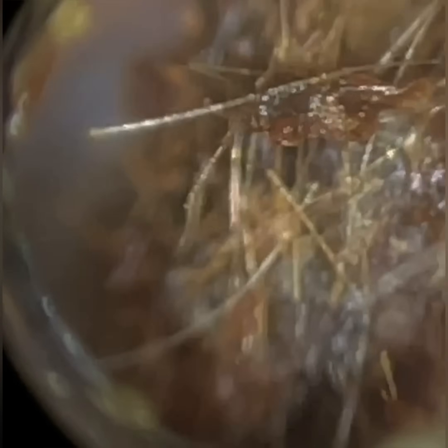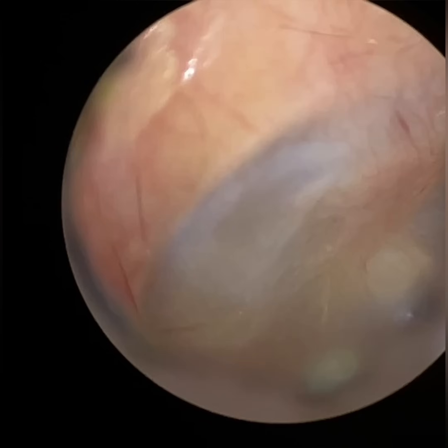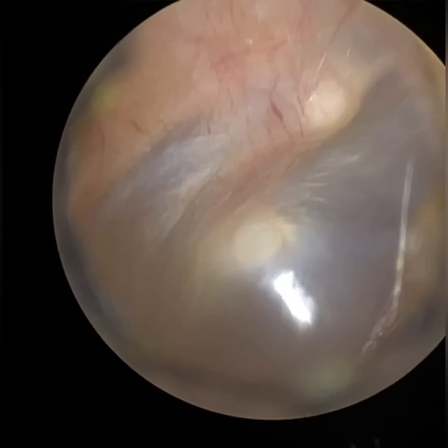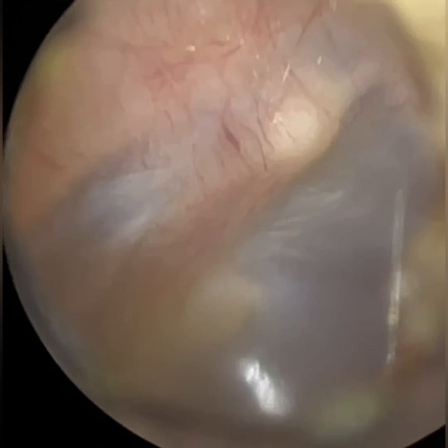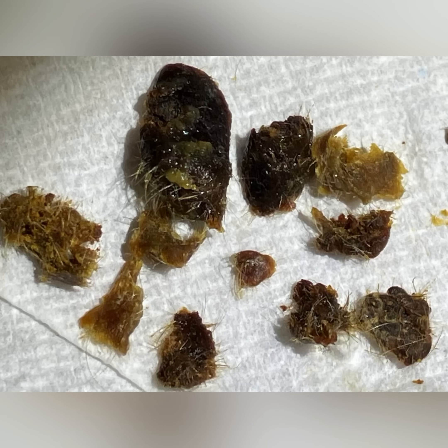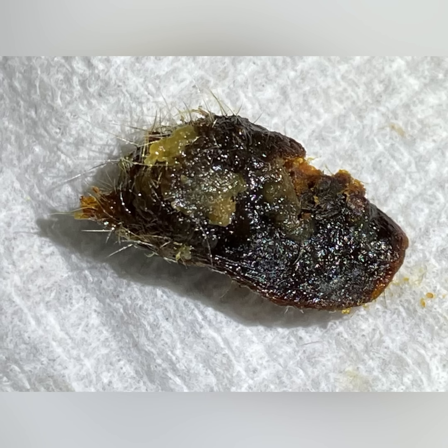When patients move slightly while using loops and a microscope, you have to readjust yourself to regain focus and position, and reposition your head or the patient's head when visualising different parts. With the Waxscope, you just move your wrist to reposition the speculum. I've just used the zoom feature to remove some wax close to the anterior canal wall near the eardrum. There's a good visualisation of the eardrum here — no tympanosclerosis, no scar tissue, no opaqueness like in the left ear. You can see the blood vessels there. Coming up are some still images — that's the wax from both ears, and you'll see a zoomed-in image of the large plug from the left ear. Just see how dark and oxidised it is — it's been there for a while.